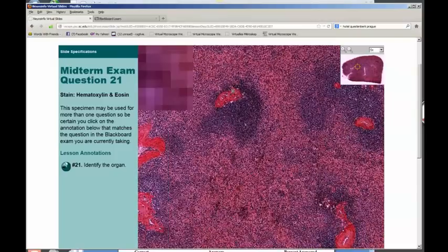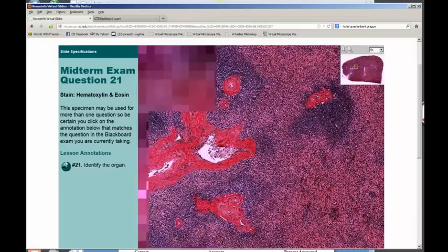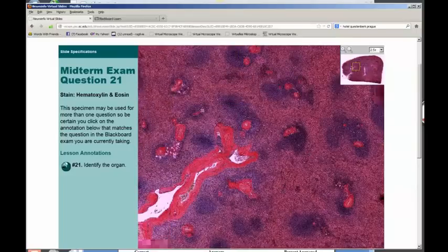Here's a central artery, and all these would be B lymphocytes. But when you're moving through the longitudinal direction of the central artery, where a lot of these are cross-section, like in here, this would be T lymphocytes. Okay, so this is spleen.